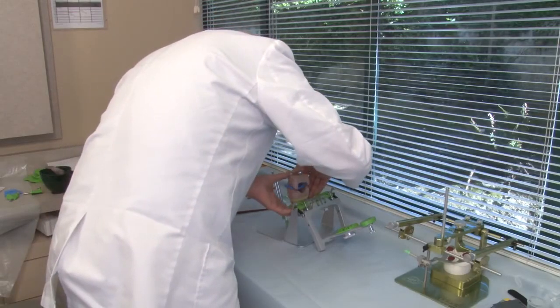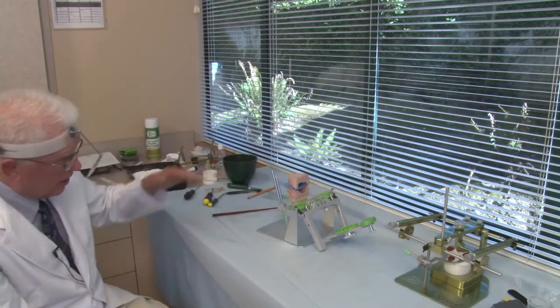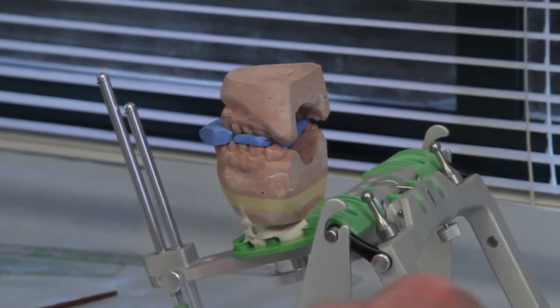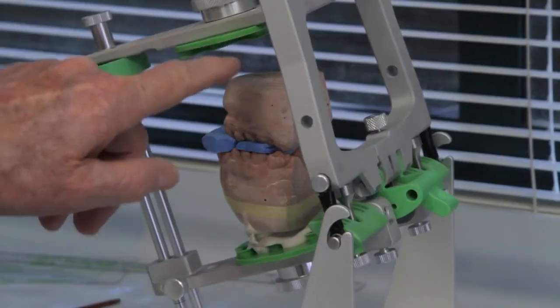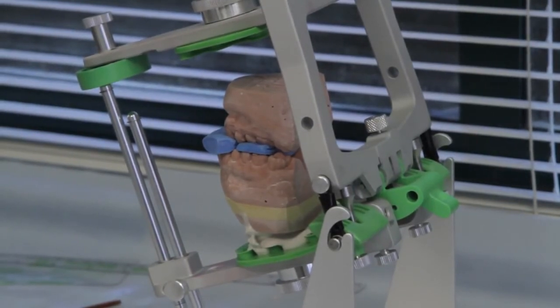I'm going to seat it with a little bit of pressure. You can see now the base of the lower model is parallel to the countertop, so when I add plaster it won't fall off. And now I have to know how much plaster to add, so I close the articulator and I look and I see the space and how much plaster I've got to add. So that's quite a bit, and so I have to be a little careful how I add the plaster.